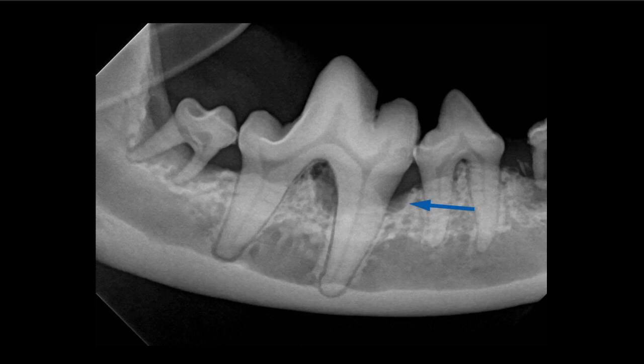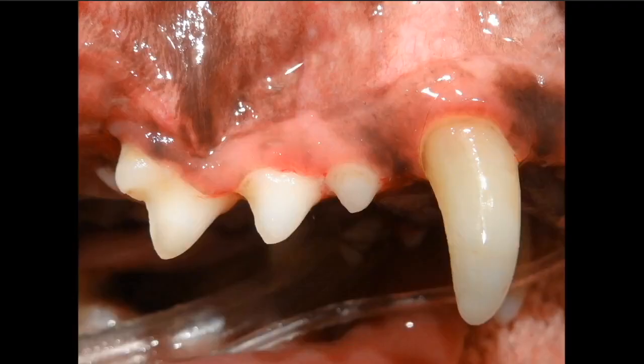You have to ask yourself: can we alter the progression based on the amount of bone loss present on the individual patient? And if we can't, then that is probably going to be an extraction. Let's look at an example of that.